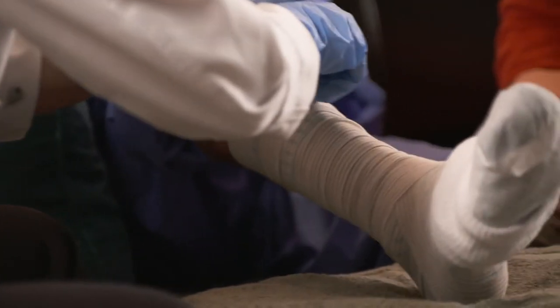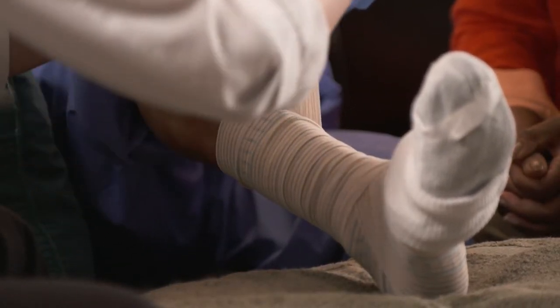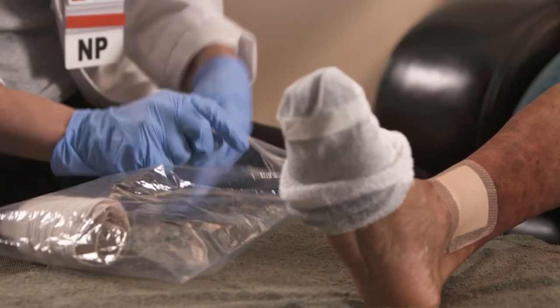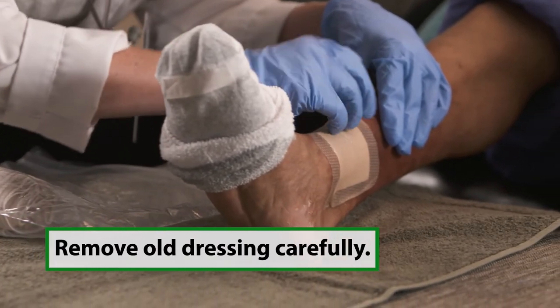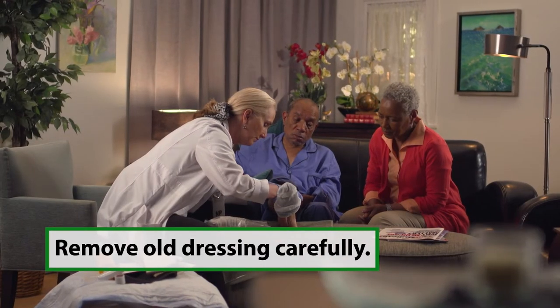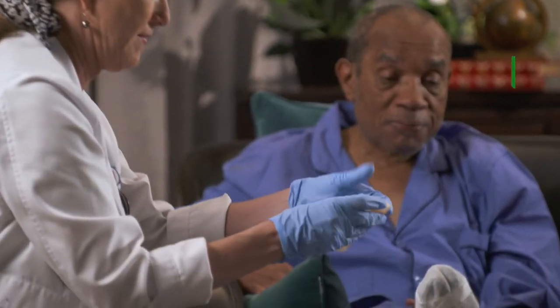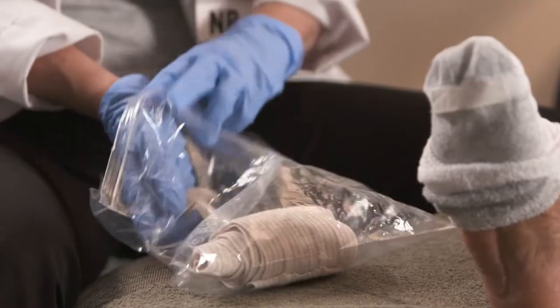To take the compression bandage off, start by removing the tape that is securing the bandage. Then unwrap the limb and dispose of the old wrap. You can now see the bandage underneath that covers the wound. Be careful when you pull the bandage away from the wound. Once you've removed it, put the old dressing and gloves into a zipped plastic bag — do not just toss them into the garbage.